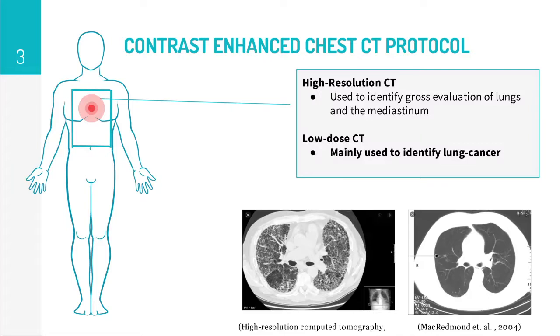One of the main differences between an HRCT scan and a routine non-contrast CT is slice thickness variance. For a routine CT scan, the slice thickness is about 5 millimeters. However, for a high-resolution CT scan, it is less than or equal to 2 millimeters. This variance in thickness is to resolve subtle reticular and nodular changes. However, thinner slices on the HRCT scan require higher doses than normal, which can pose a problem. CT scanner software uses dose reduction techniques as well as a low-dose HRCT method, which has little change in the image quality.